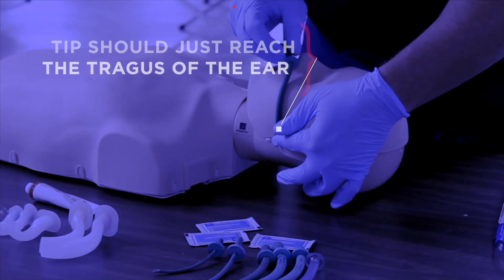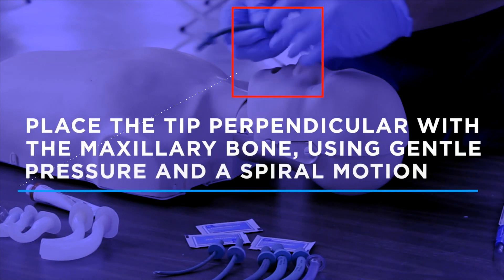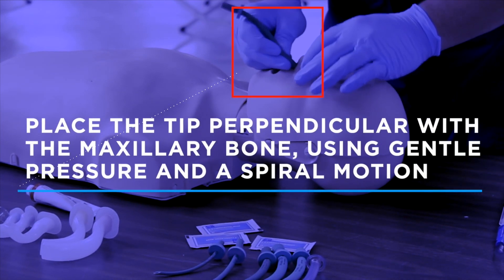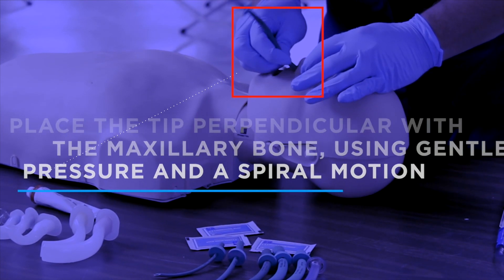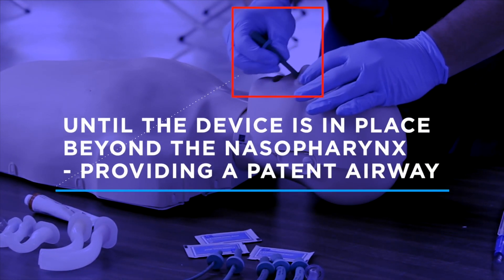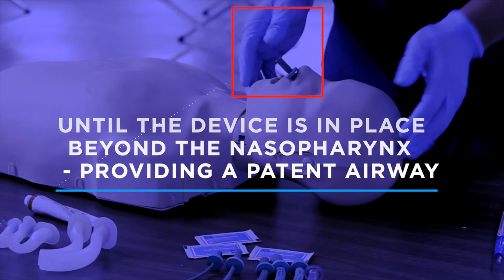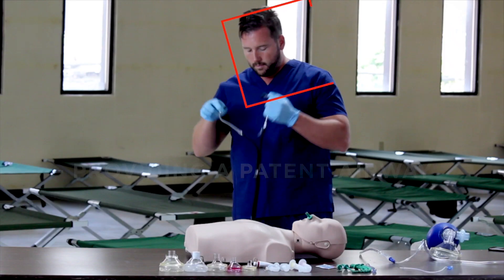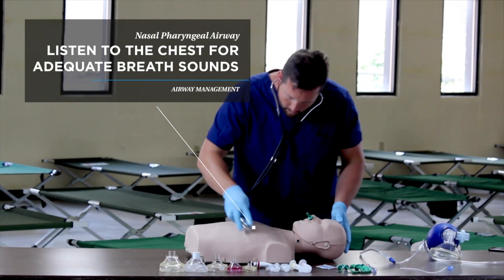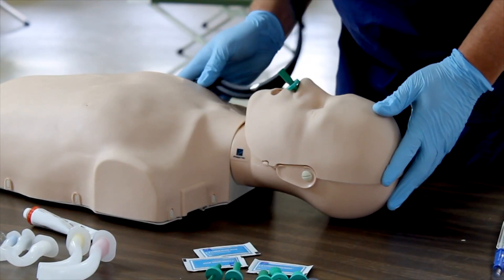To insert the nasal pharyngeal airway, place the tip perpendicular with the maxillary bone using gentle pressure in a spiral motion until the device is in place beyond the nasal pharynx, providing a patent airway. After placement, listen to the chest to ensure that the patient is receiving adequate breath sounds.